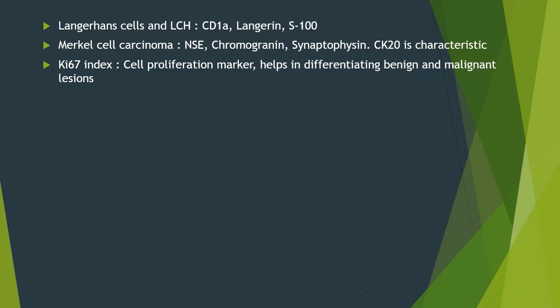So this is overall about the skin and adnexal histology, along with some other elements of skin biopsy, how we can identify different parts of the skin of our body, and also the handling of the biopsy specimen, common immunomarkers, and common cytochemical stains.